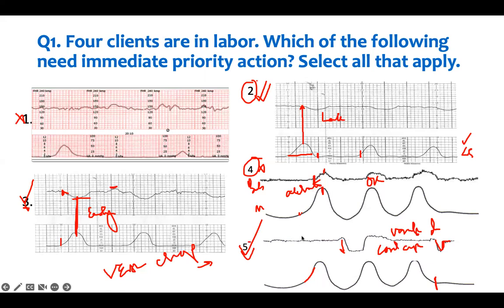Straightforward, very important. I know when you see it, you get scared, but just know, especially with the next generation cases, this is a typical one they can put in there for you to analyze everything, to make a treatment, have multiple drop-offs, and do a lot of SATA, select all that apply. It may be multiple SATAs in that, because I can ask you so many questions on this tracing. What do you do next? How do you intervene? What do you expect? So that's why I'm training you here. So I hope this is helping.